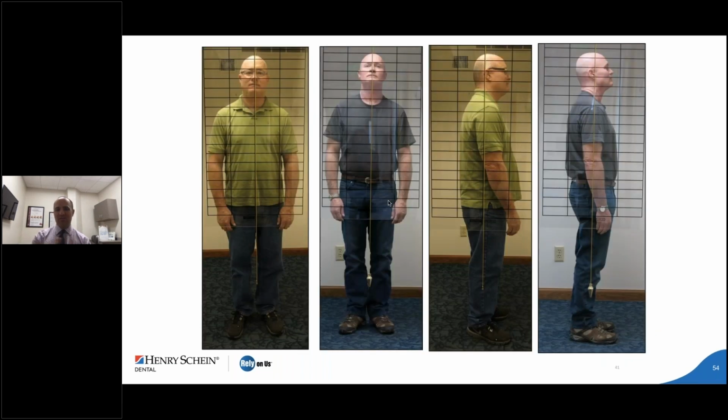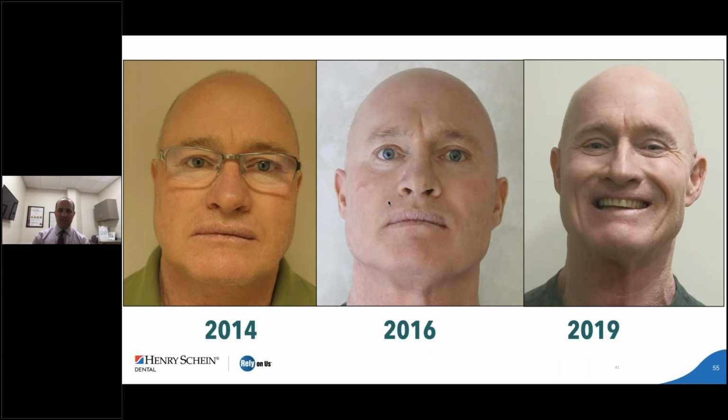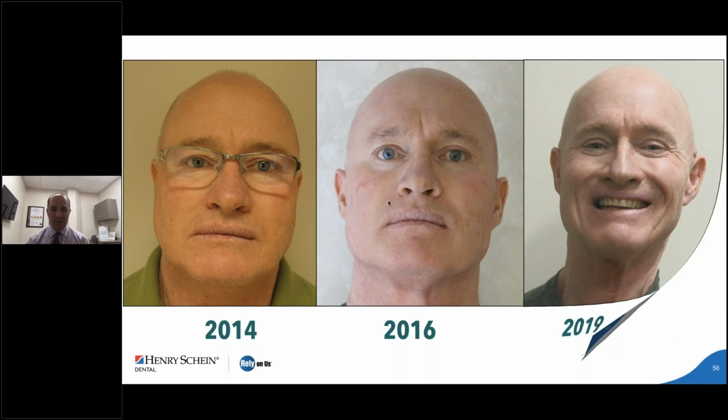But what's cool is to see how much weight he lost. And then as we did a follow-up sleep study, AHI was down to, I think, 2.1. I might have it in here. But we followed these patients. So now Ivan, 5 years later, you can see he continues to lose weight, and you can really see his masseter hypertrophy is decreasing as well. And so he's doing great. He still is in the same EMA. It's going strong and he hasn't had an issue with it. And I know that when he has an issue with it, we're just going to remake it because he's been doing great along the way.